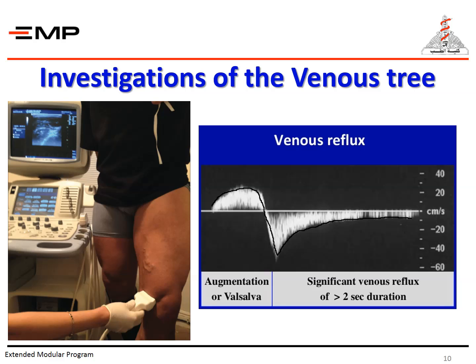This is visualized within the venous duplex, and you can trace these graphs and document that there is venous reflux beside the sound of venous reflux. We'll demonstrate how is this happening and how to use your pocket Doppler to detect venous reflux in your face-to-face sessions.